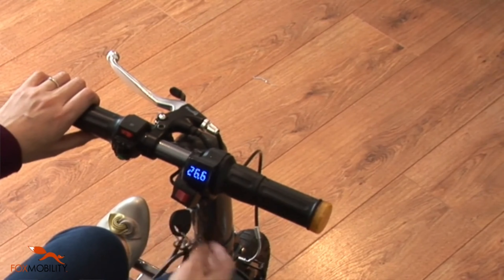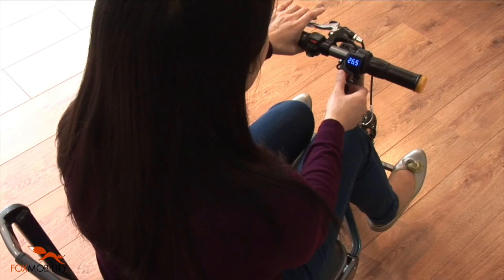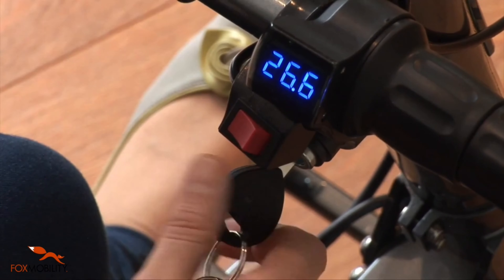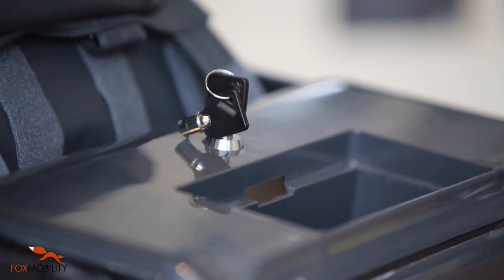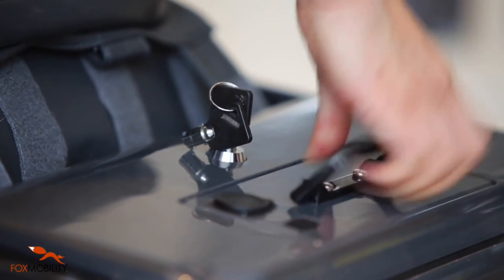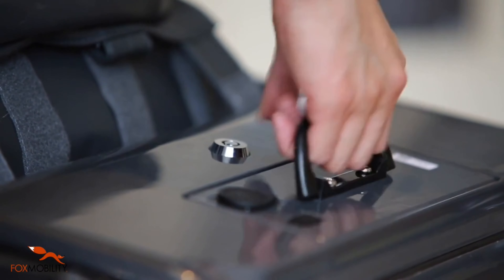When the main switch is switched on, the display on the handlebar shows the voltage of the battery. Showing 29 or above means the battery is full, while below 23 means it needs charging. To maximise the lifespan of the battery, it is highly recommended to charge it often and well before the voltage display drops to below 23.